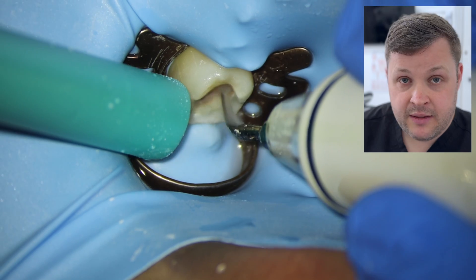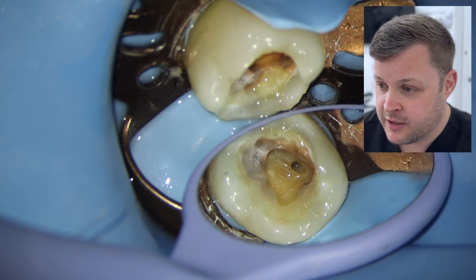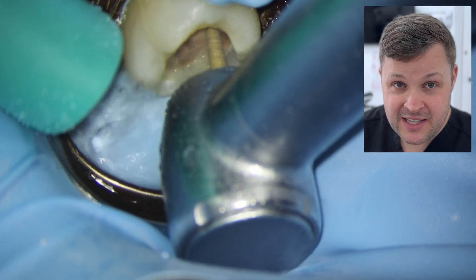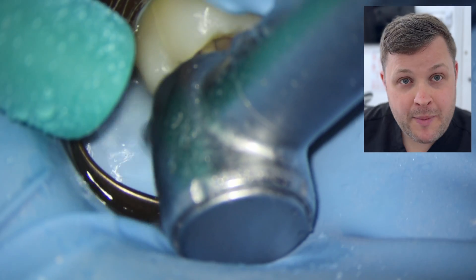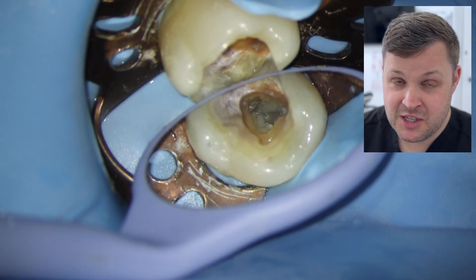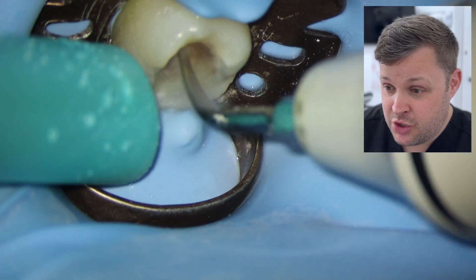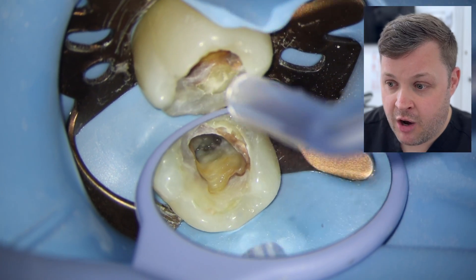We're using a high-energy ultrasonic tip here just to break the roof of the pulp chamber, and as you can see we've obviously exposed it — there's a nice little drop that you feel. What I'm going to use now are Endo-Z burs. These have a blunt, non-cutting end, and the great thing is you can just drop these burs into the space and follow the walls of the pulp chamber all the way around without worrying about perforating the tooth. You can create a relatively conservative access cavity, removing only the tooth tissue required. Then just cleaning it up using an ultrasonic with water — we can see three very obvious canal orifices.